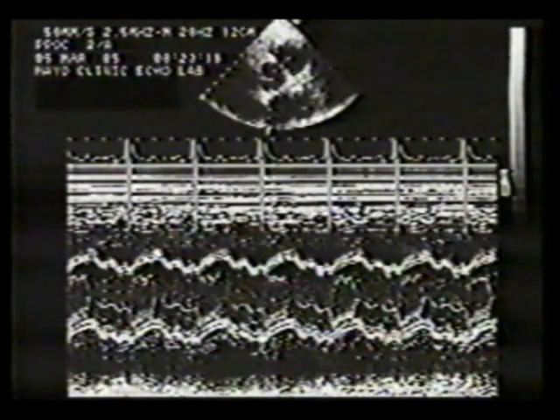In this case, the aortic valve opens and closes normally, but the cusps are slightly thickened or sclerotic. This makes it much easier to identify their M-mode pattern throughout the cardiac cycle. Typically, only two cusps are identified. The anterior is the right coronary cusp, and the posterior is either the left or non-coronary cusp, depending on the exact angle of the M-mode cursor.